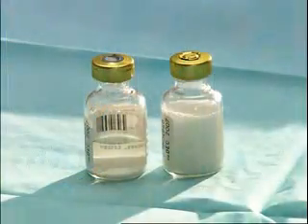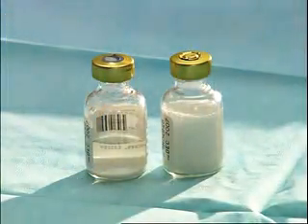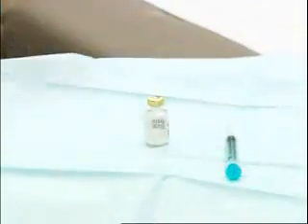A suspension is produced when fine particles remain after the diluent is added and mixed. Because the particles may settle in the vial, the suspension must be mixed just before the medication is drawn up. To ensure adequate mixing, be sure to follow the directions on the vial label. Either roll the vial between your palms or shake it vigorously, depending on the manufacturer's directions on the label.